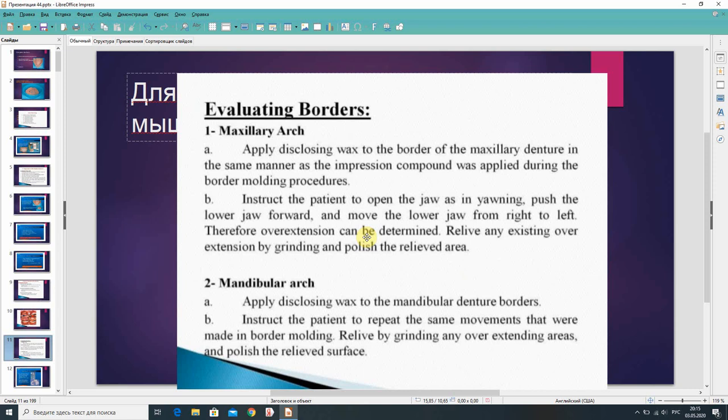Therefore, overextension can be determined. Relieve any existing overextension by grinding and polish the relief area. For the mandibular arch, apply disclosing wax to the mandibular denture borders. Instruct the patient to repeat the same movements that were made in border molding. Relieve by grinding any overextending areas and polish the relief surface.